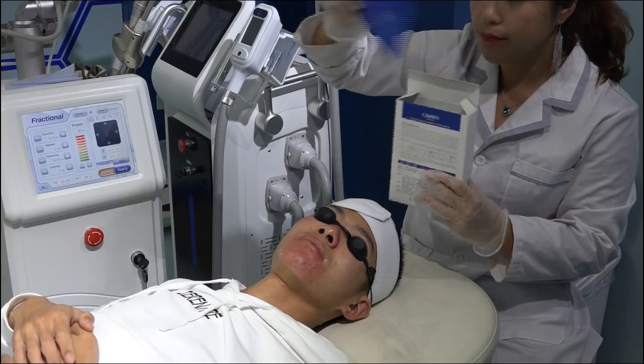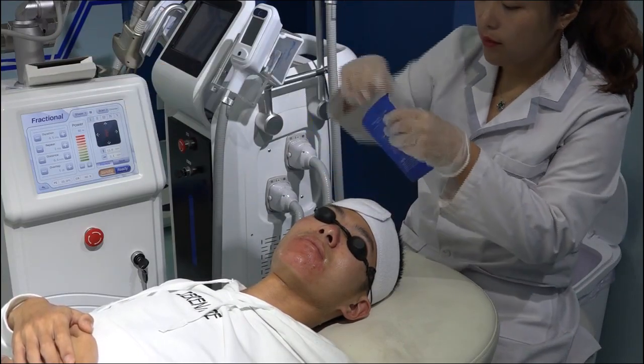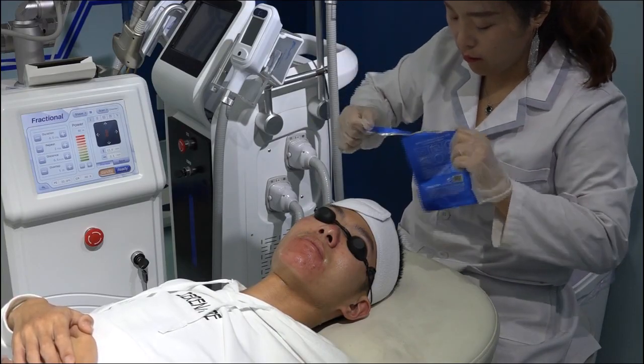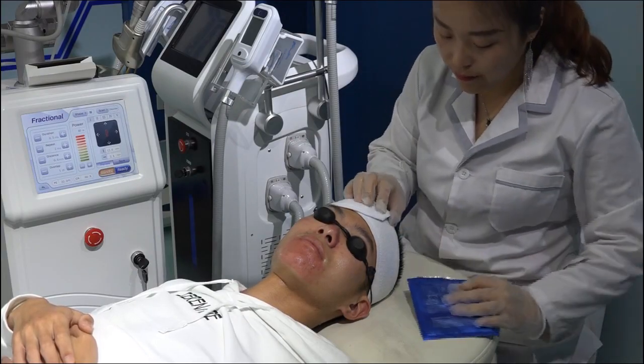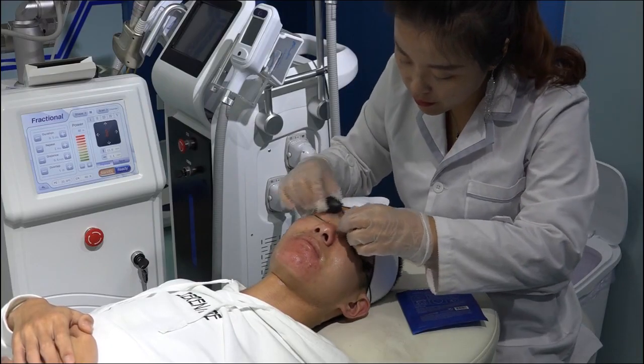Use this one. Okay. You can take off this.